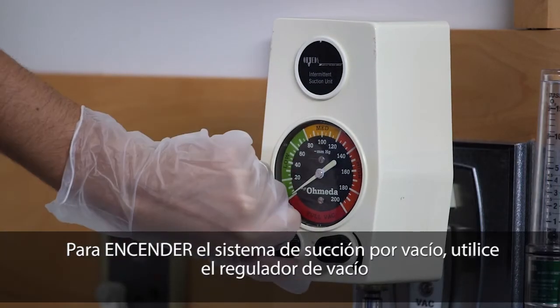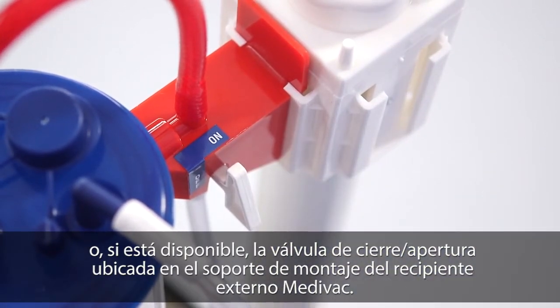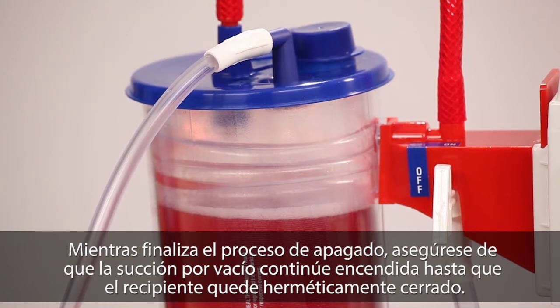Turn vacuum suction on using either the vacuum regulator or, if provided, the on-off valve located on the bracket of the reusable outer canister. While completing the shutdown process, ensure the vacuum suction remains on until the liner is properly sealed.